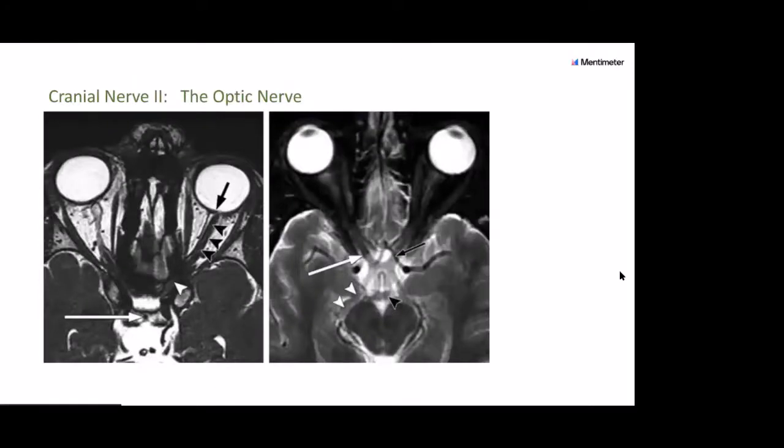The second cranial nerve is the optic nerve. It has 4 segments. The important thing about the optic nerve is it has a retroorbital segment, then the intracanalicular segment, then the prechiasmatic segment. The thing which is important is that you have to remember the structures around the chiasm and its relation to the pituitary stalk. The segment which is mostly overlooked, that is my second question, and then I will tell you about its answer and its further explanation.